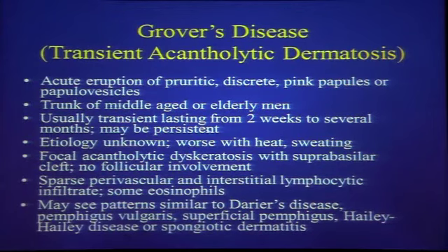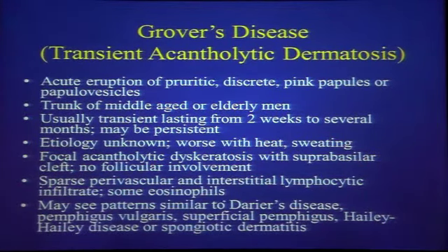We don't know exactly what causes this, but it tends to be worse with heat and sweating. And if you do get acantholysis, it doesn't tend to involve the follicles, so that can help you to distinguish it from Darier just looking at it under the microscope. One interesting thing about it is you can see some other patterns.